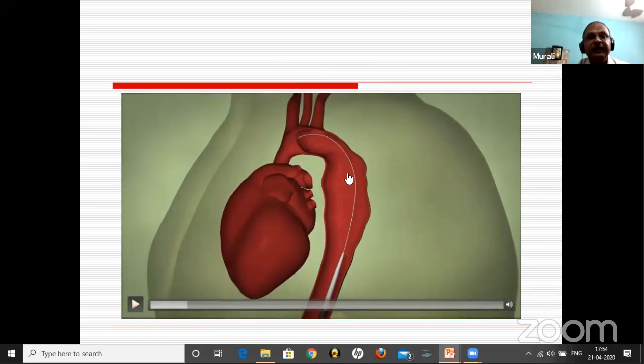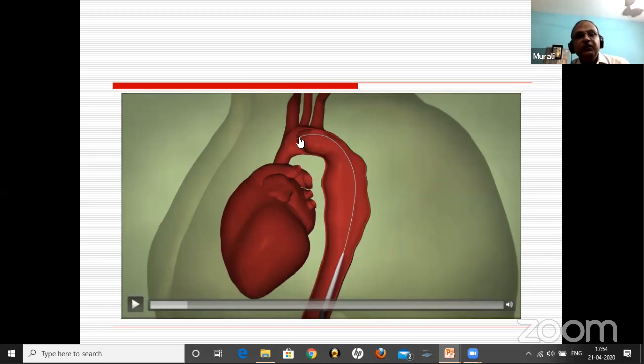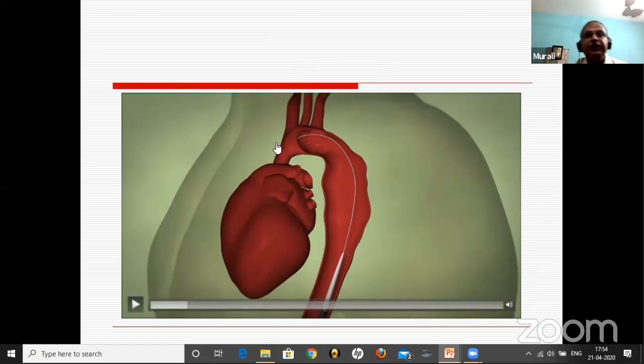You're going to take the catheter and put in a stiff guide wire. The two important things are that the guide wire has to be in the ascending aorta. If you can get into the LV, it is good, but you don't need to. If you get into the LV, sometimes a lot of arrhythmias will occur, so don't push into the LV. Come very well into the ascending aorta with your stiff wire. Then you pass the graft.